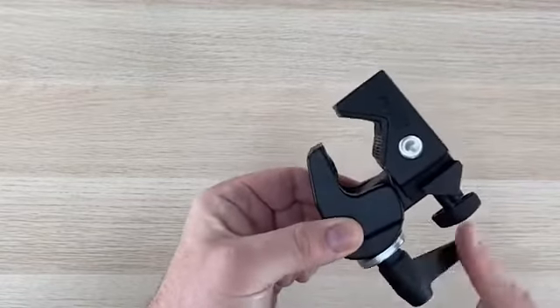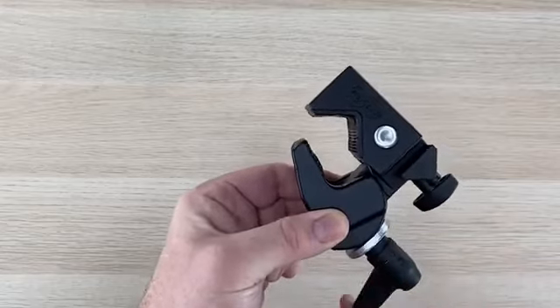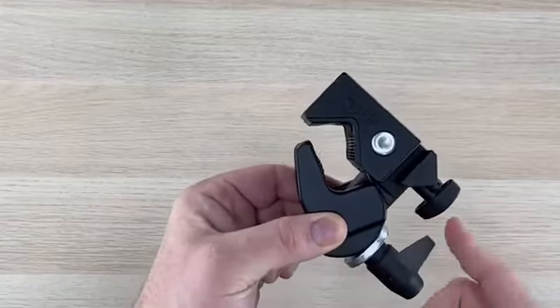Turn the tightening nut until it clamps down and locks.